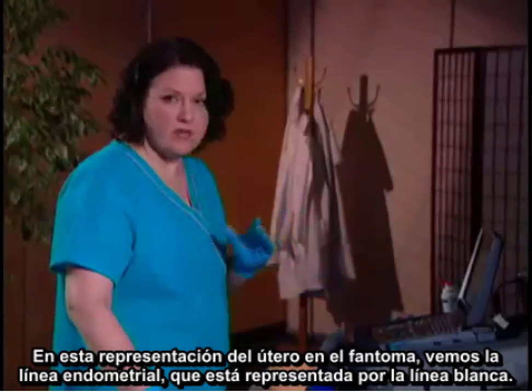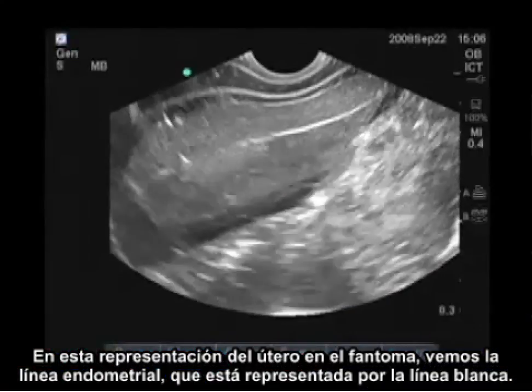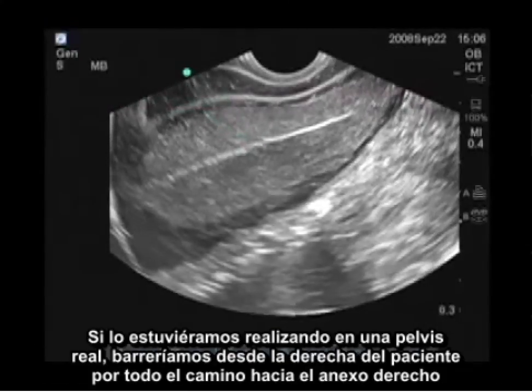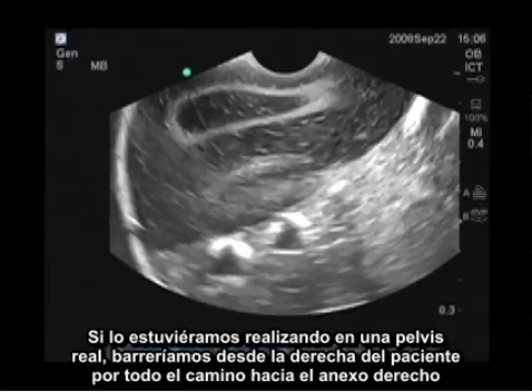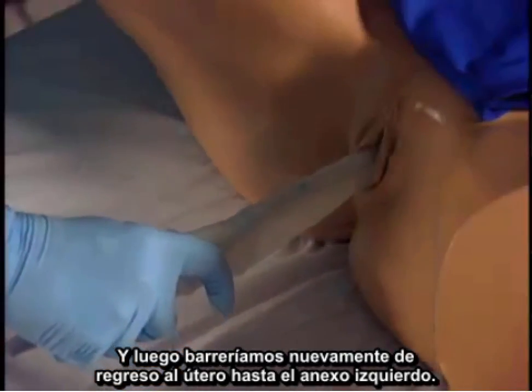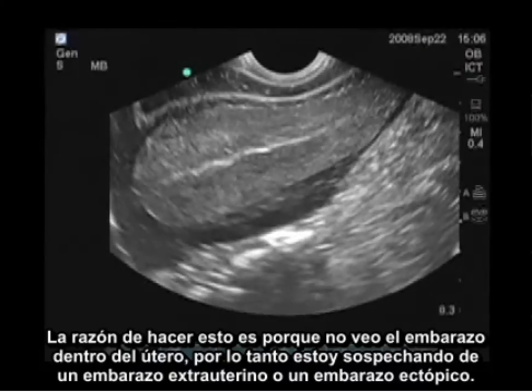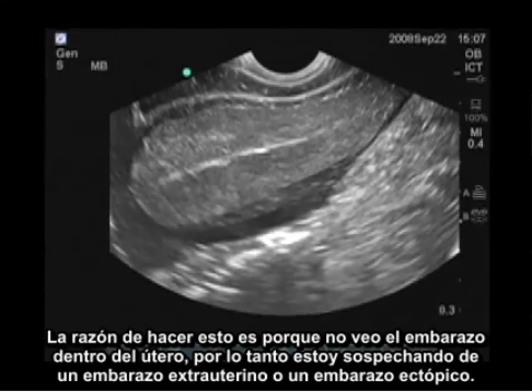In this phantom representation of the uterus, we see an endometrial stripe, which is represented by the white line. If I was doing this as a real pelvic exam, I would scan to the right of the patient all the way through to the right adnexa, and then back over all the way through the uterus over to the left adnexa. The reason I'm doing this is because I don't see the pregnancy inside the uterus.